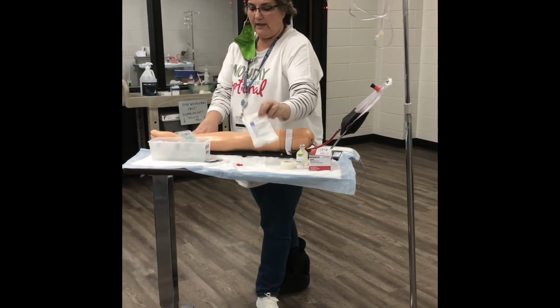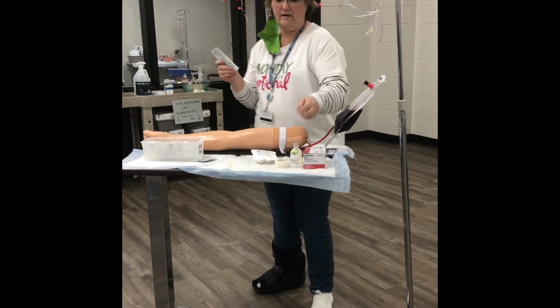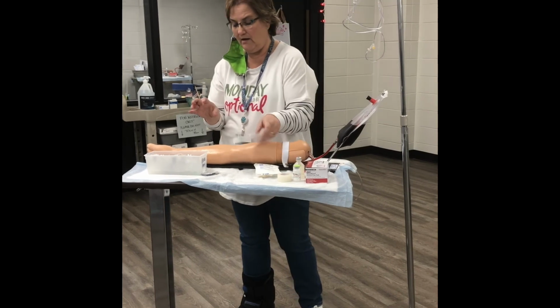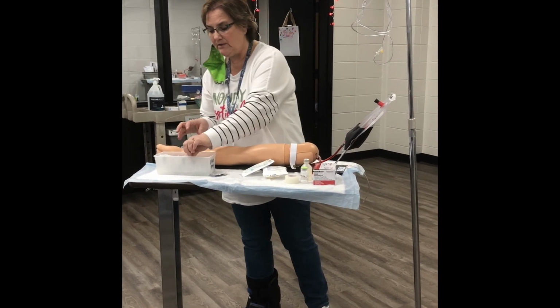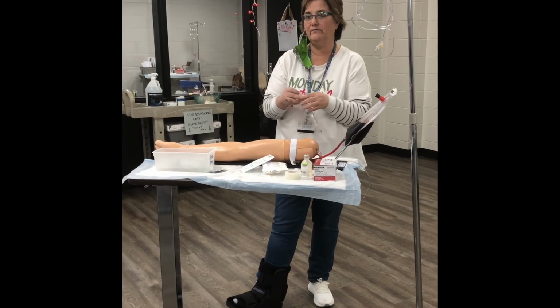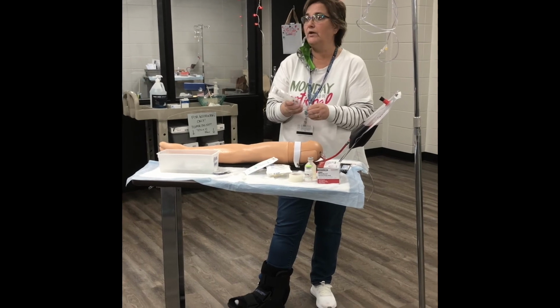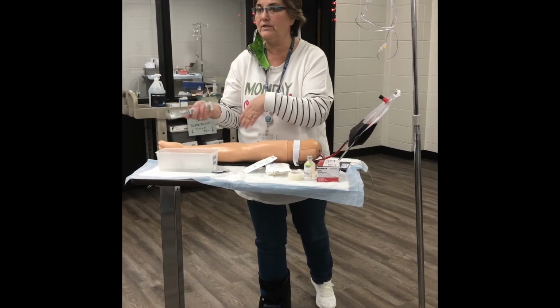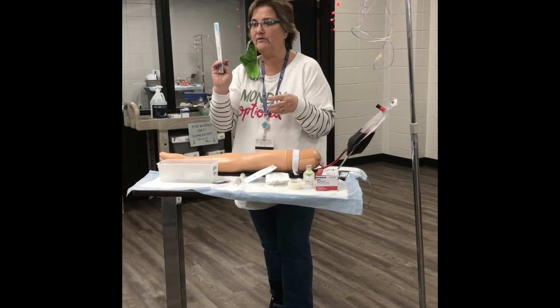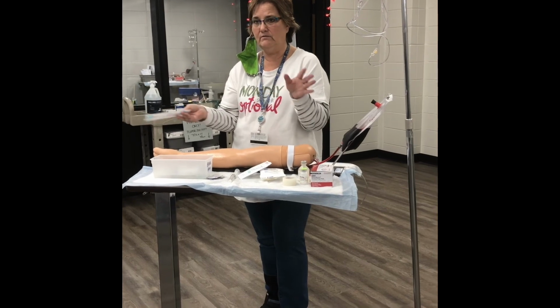And so once this is done, it's ready to go to our patient's room, so we're good. You need a start kit. We're going to start our IV as an INT line, and then initiate our fluids. So you will need an INT port. Now, in your competency, you will have these pre-filled flushes. To practice in your bag, you don't have them. So what you need to do is get one of the syringes out of your bag and make yourself a flush with saline. So you'll need one of these, and you'll need a catheter to start. There'll be gloves and alcohol pads and all that out if you need any of that.